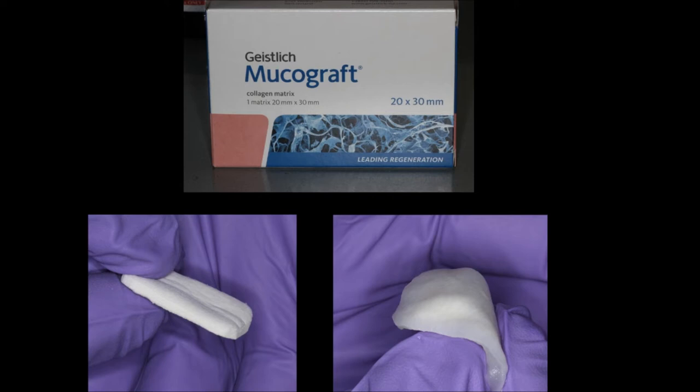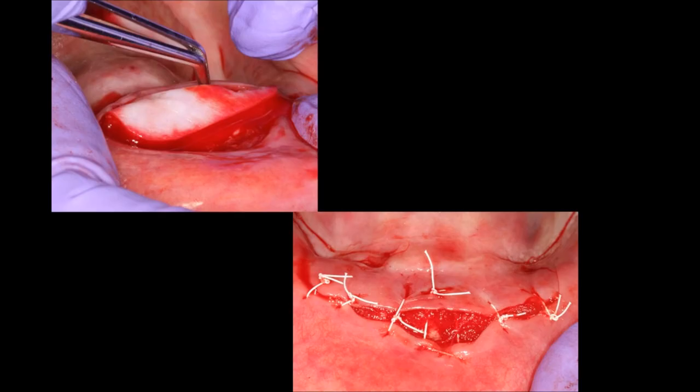In this case we use Mucograph as our grafting material. On the lower left you can see the material, and on the lower right you can see it after it has been soaked and softened to make it more malleable. The graft is being placed, and on the lower right you can see the suturing.